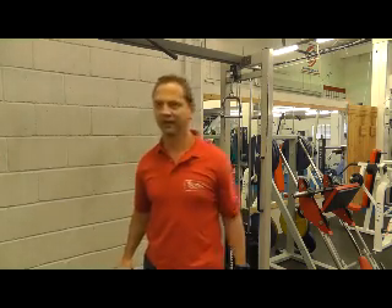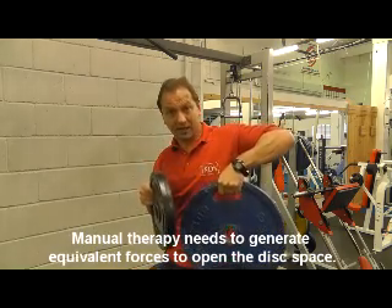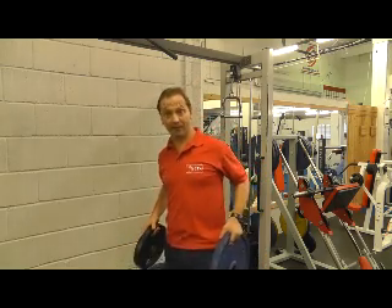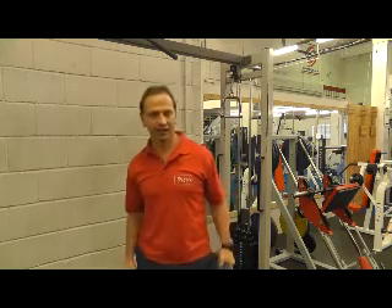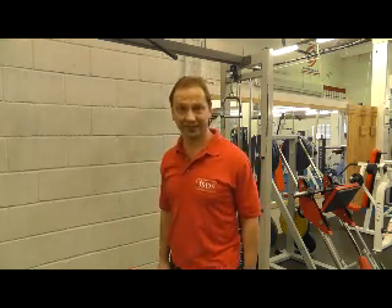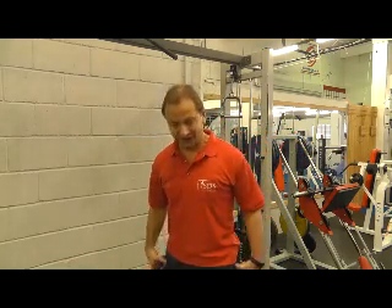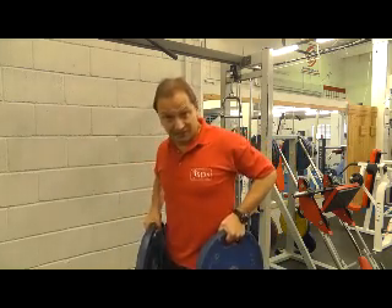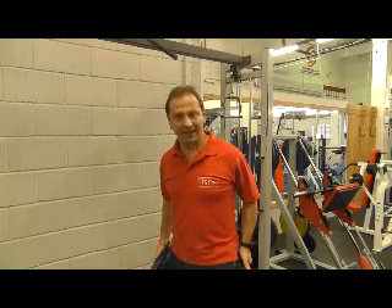If somebody weighs 60 kilos, that means we're applying 30 kilos — comfortably and gently along the length of the spine, controlled at the pelvis. And if you get someone around 80 to 90 kilos like me, that's 40 kilos of force being applied gently and comfortably. I'm putting a lot of strain just to physically lift that — so to achieve this with the hands is simply not possible.